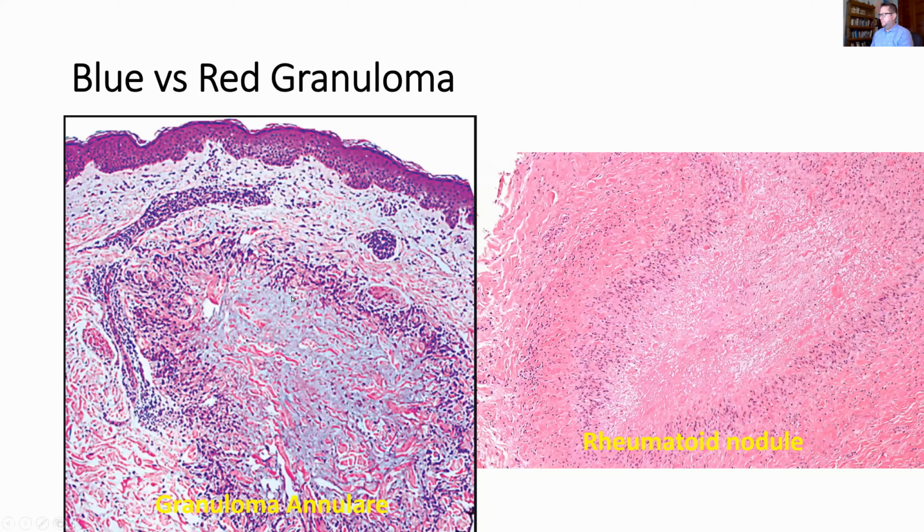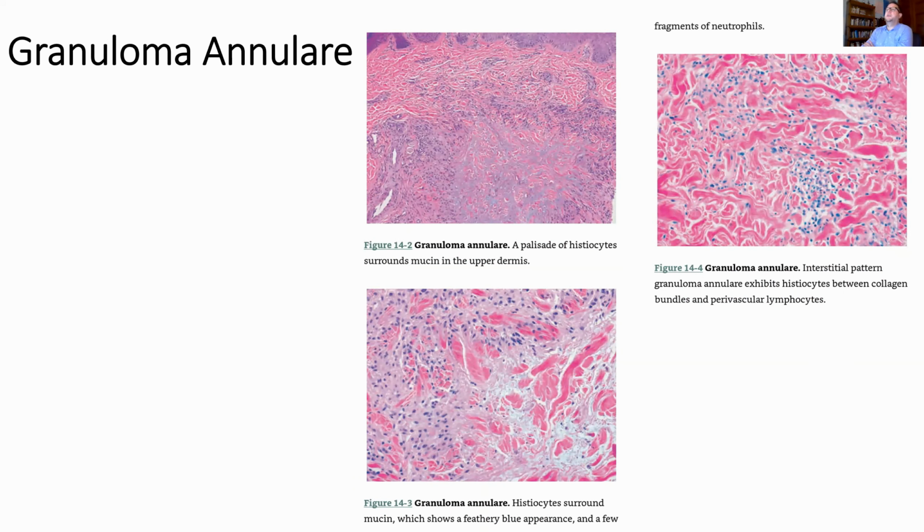So moving on, granuloma annulare, it's my favorite term in all of dermatology because it fits the histology, granuloma, and it fits the clinical. Lesions are often annular. So we have such terrible names with mycosis fungoides, but granuloma annulare wins. There's many associations with granuloma annulare, and basically, I guess the board question is it's been associated with everything. So there's reports of it, but it's hard to really understand this because it's so common. So it's not uncommon for us to see incidental biopsies of granuloma annulare.